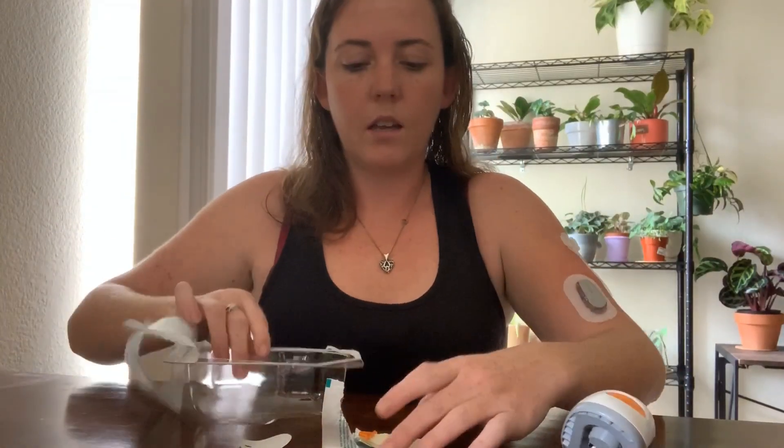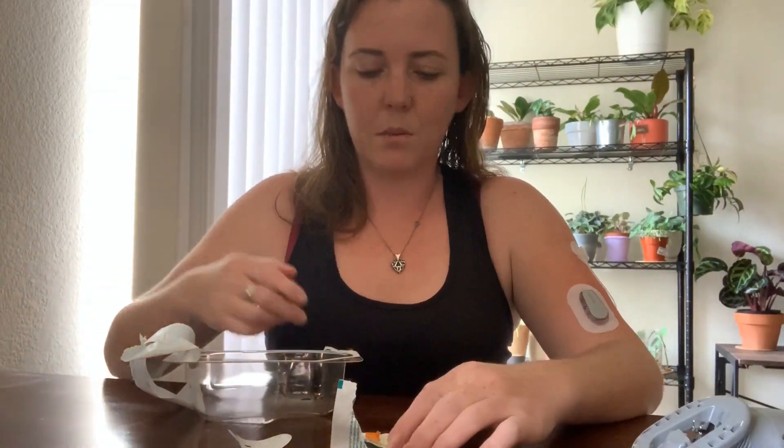I click it in — barely felt it. Then I take my transmitter, pop it in, and rub around the edges. And there we go, I'm ready to get it started again.